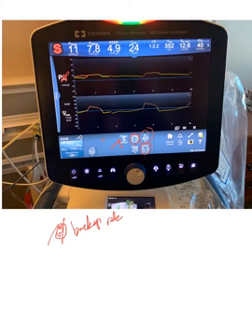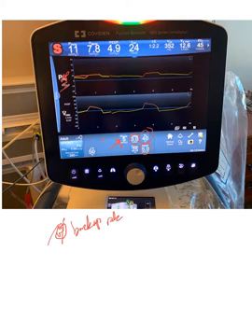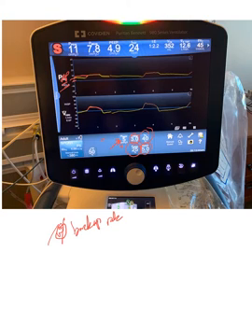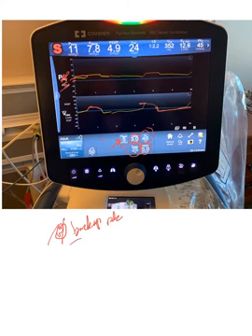You need to provide the pressure support number — how high you want the proximal airway pressure to be during inspiration. This will be added on top of five, so we don't start at atmospheric pressure but at five. The cycle, as you see, is a flow cycle at 25%. The orange represents inspiration, and at 25% of the peak flow the breath terminates and expiration starts.